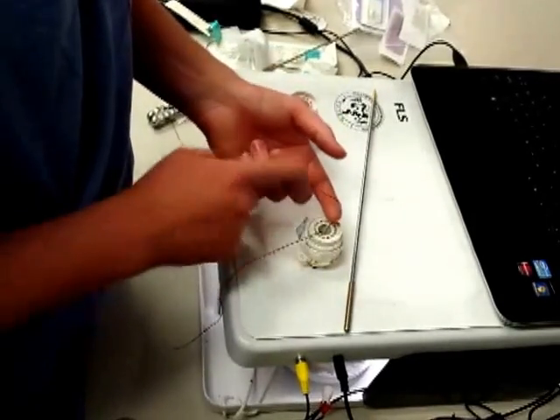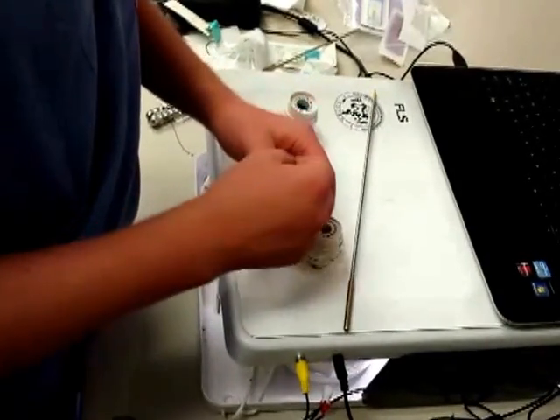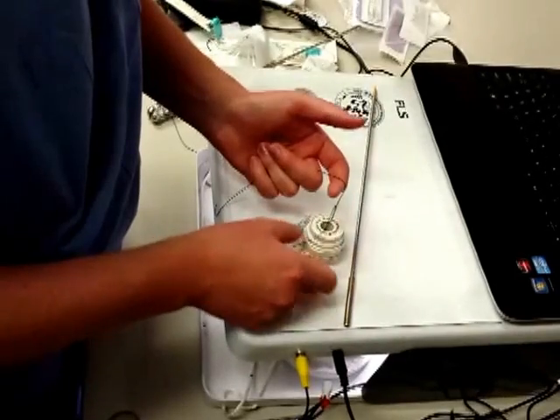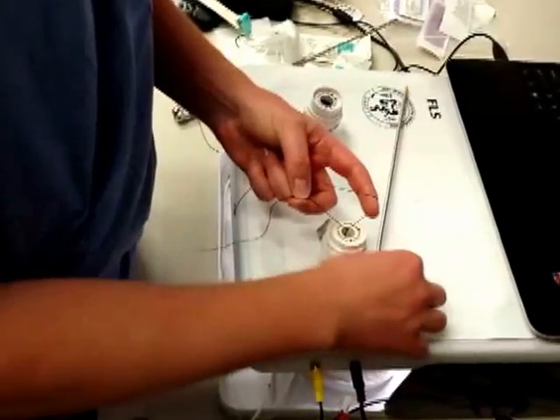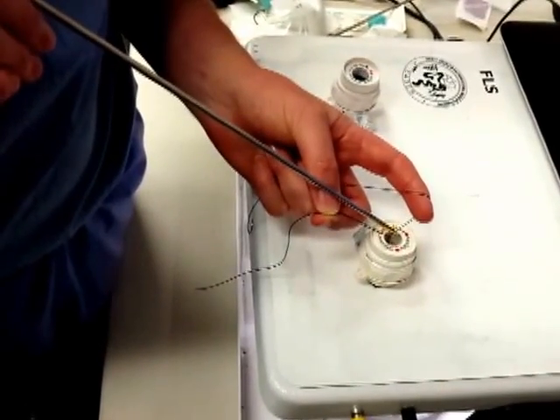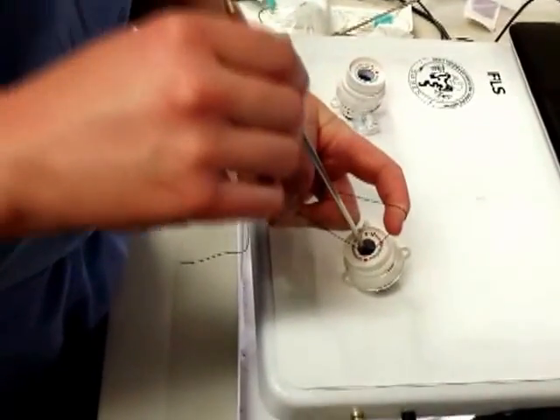This is how we recommend that you repetitively perform the tying of the extracorporeal knot. The suture with the needle should be placed into your non-dominant hand, holding the suture in the palm in a position to do a two-handed throw. The suture with the needle still attached should be placed over the index finger, and the free end should be grasped between the thumb and ring finger of the non-tying hand. The knot pusher can then be rested on the thumb of the non-tying hand, placed onto the suture, and both strands pulled up to deploy the knot down onto the target.